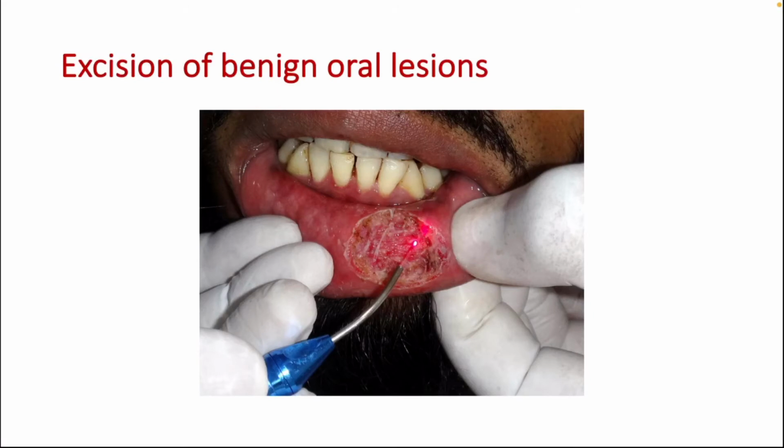Laser is also used in excision of benign, malignant, and potentially malignant oral lesions. As for benign lesions, excisions of lesions such as fibroma, papilloma, mucocele, and gingival lesions have been performed extensively in the past years. Removal of these lesions using laser is minimally invasive and can make the surgery less extensive or expensive and may reduce the need for general anesthesia or inpatient hospital care, resulting in lowered overall cost.